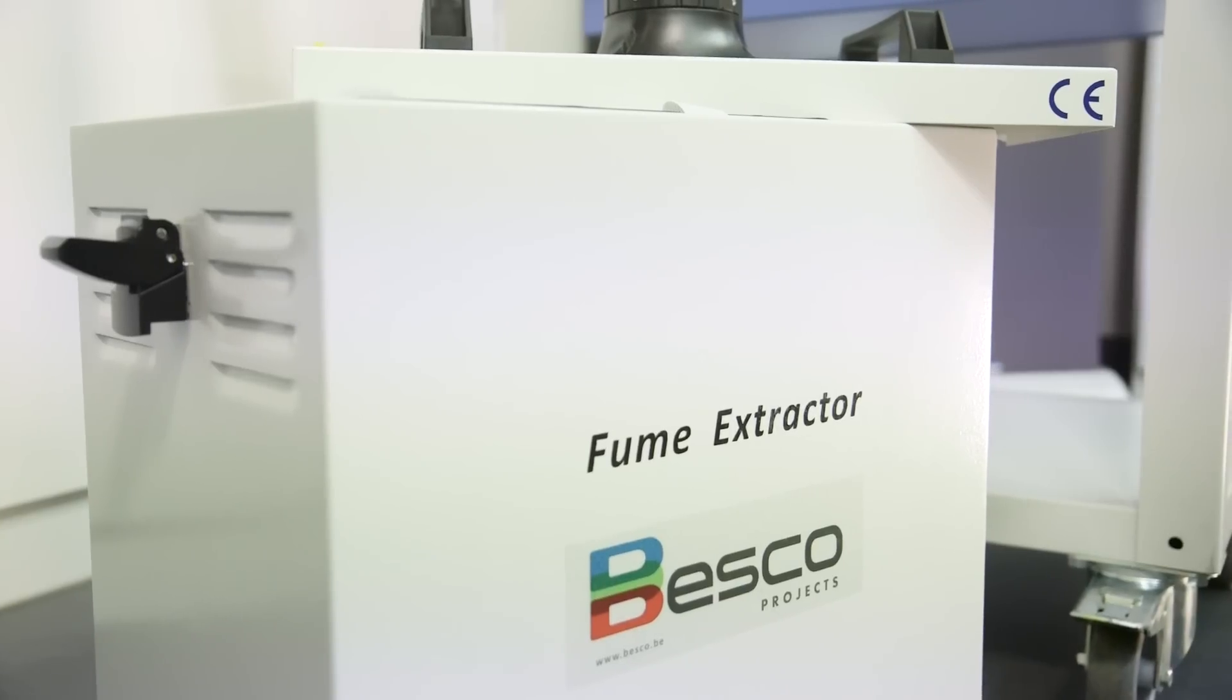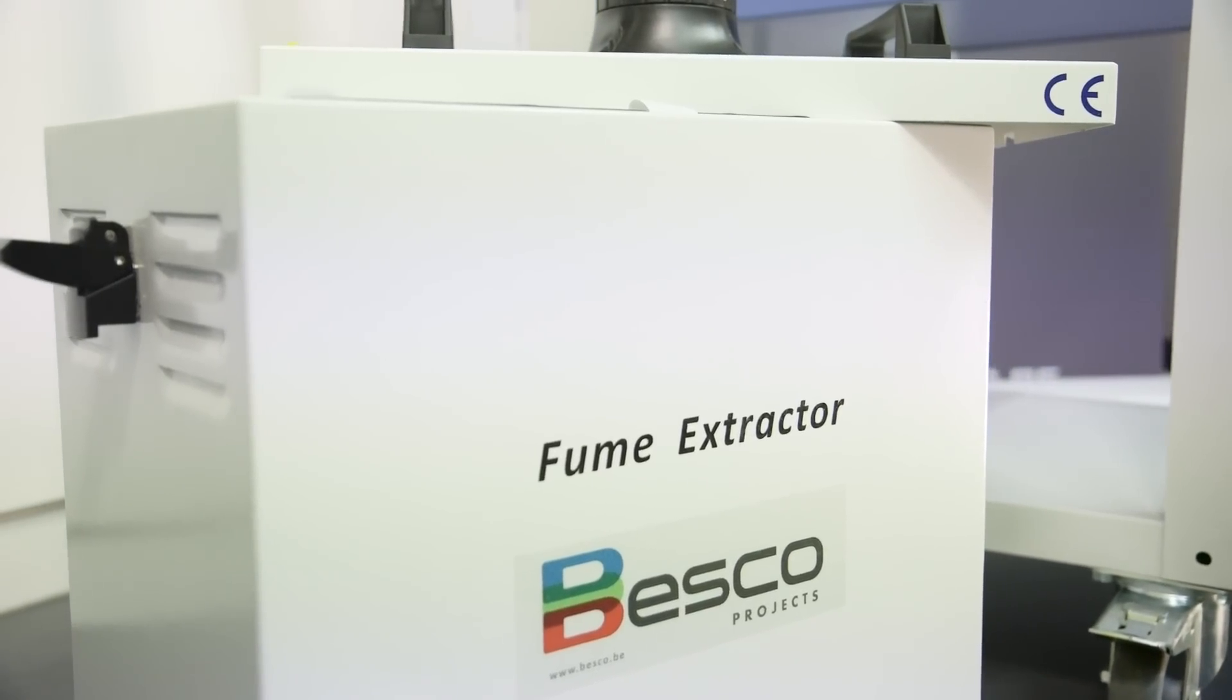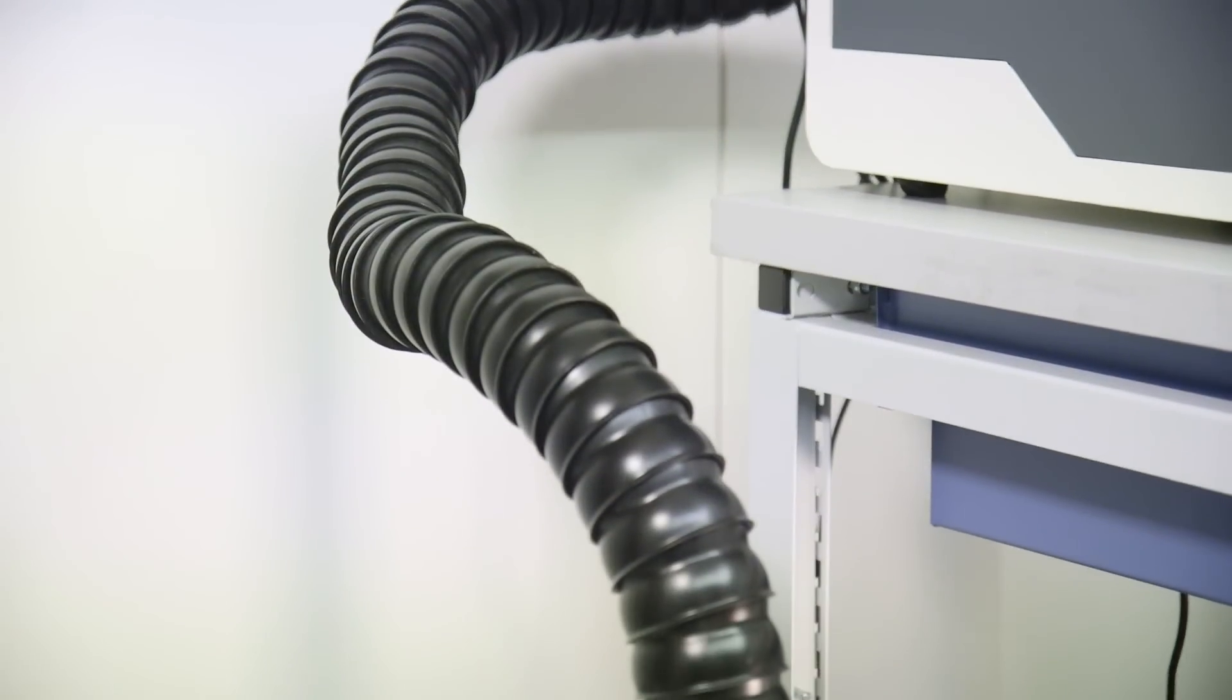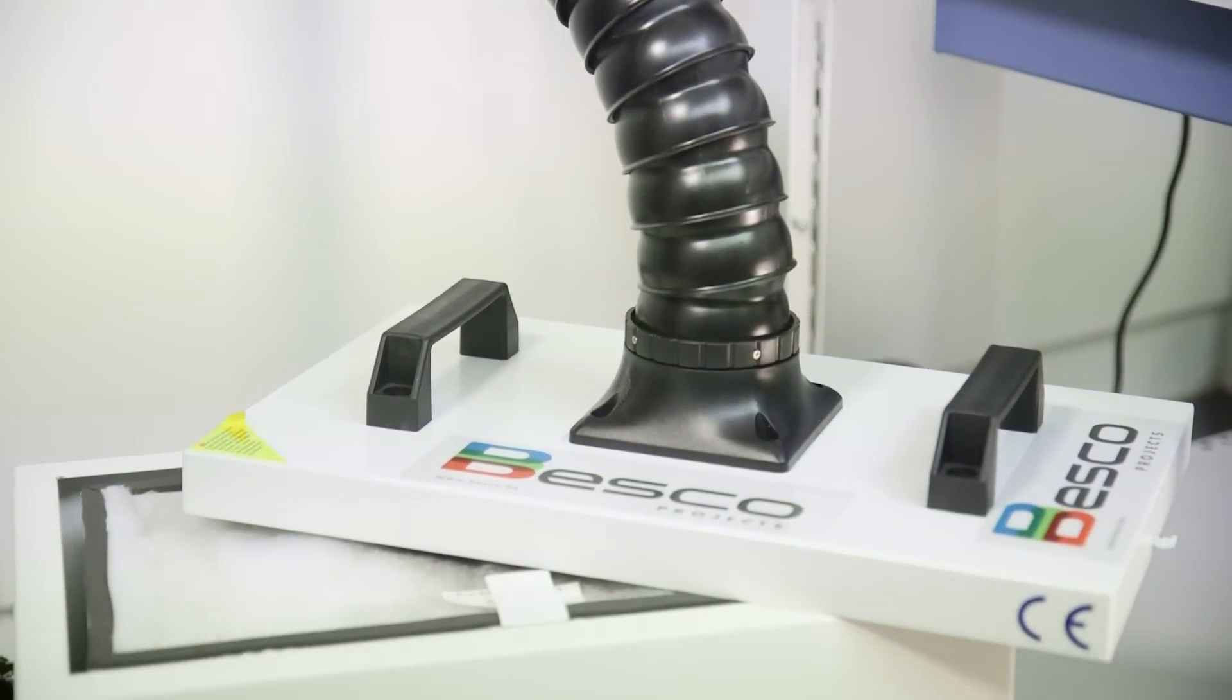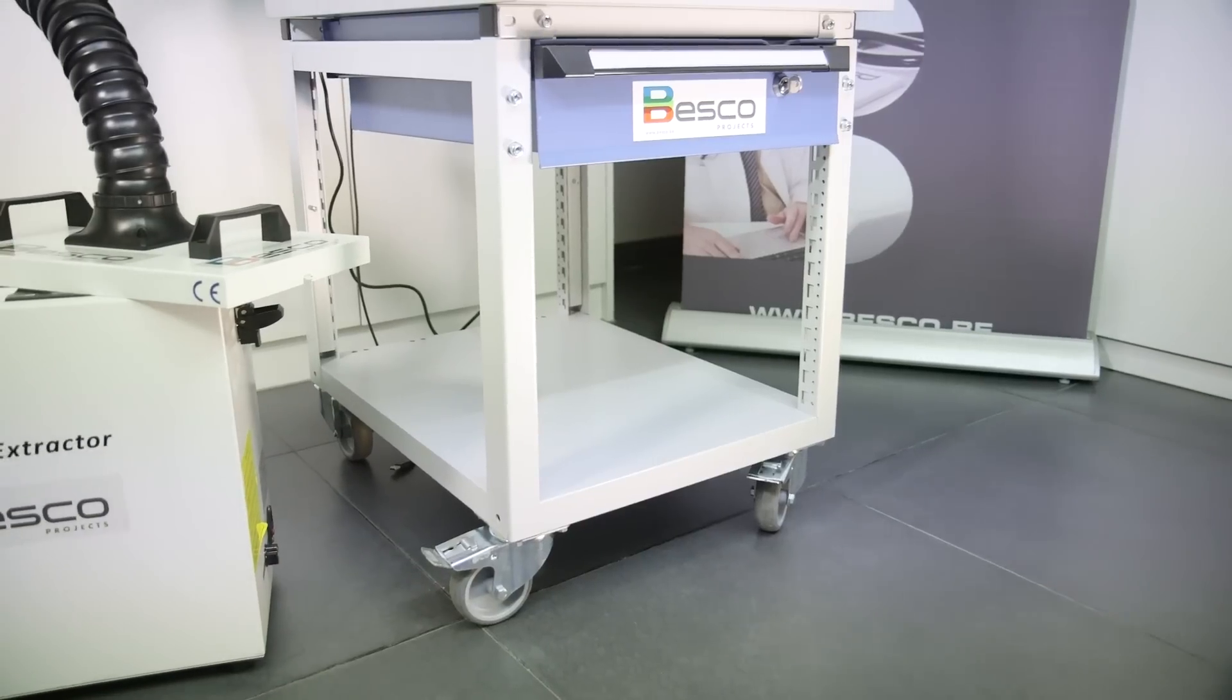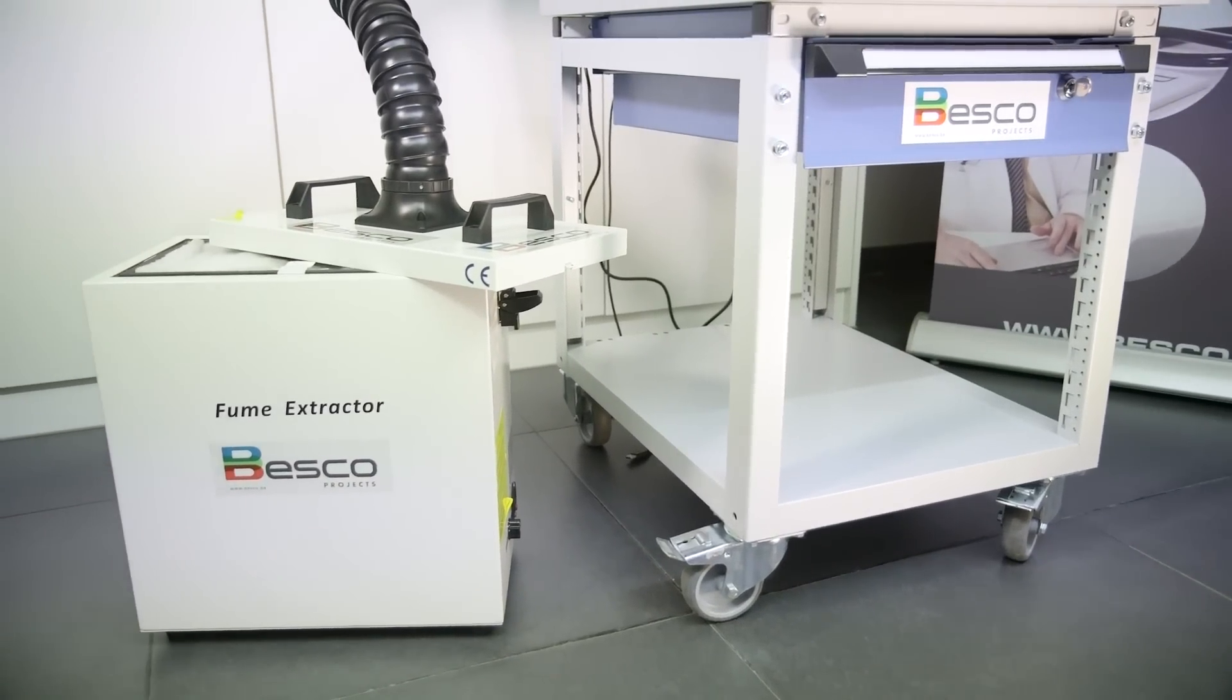The Besko Fume Extractor with HEPA filter and flexible tubing is easy to install in every office and allows to laser plastics without connection to an external extraction system.